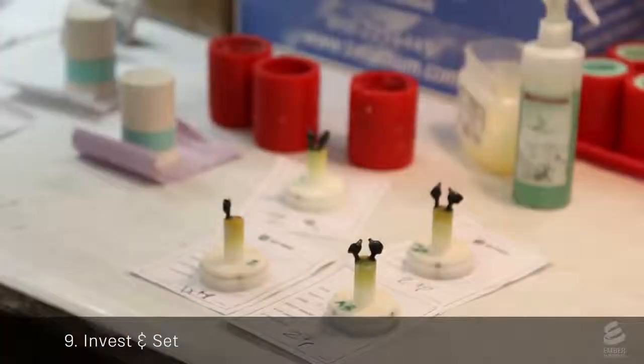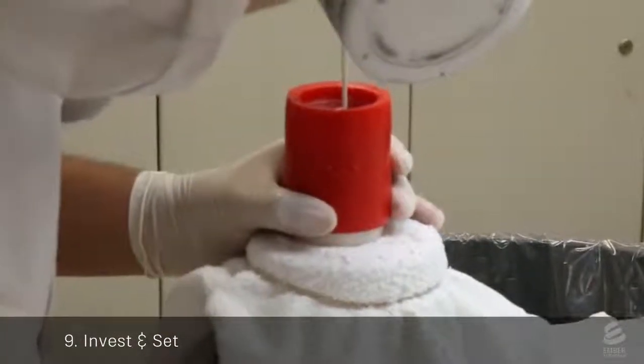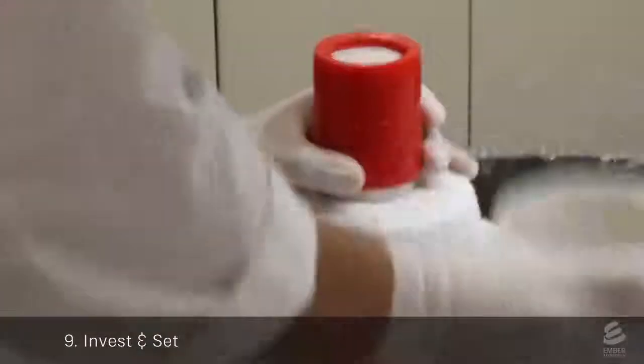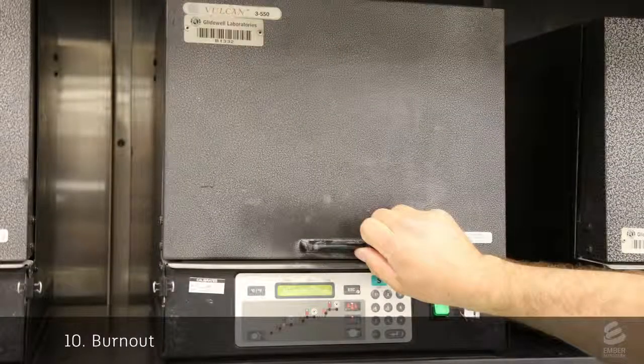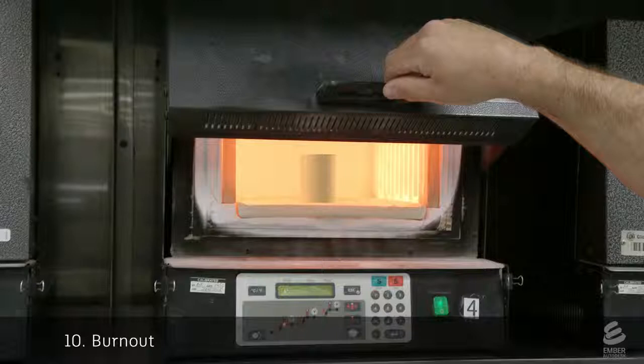The sprued crowns are put into a mold and a technician mixes up the investment material and pours it around the crowns. When the investment is completely set, it's put into an oven until the heat completely vaporizes the wax and 3D printed crown, leaving a crown-shaped void inside the investment.